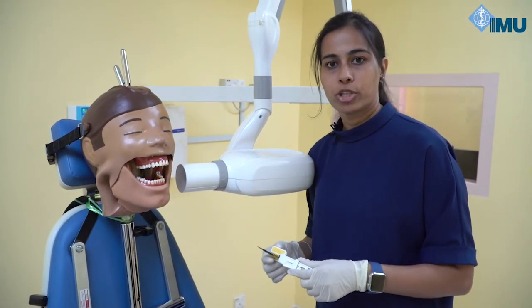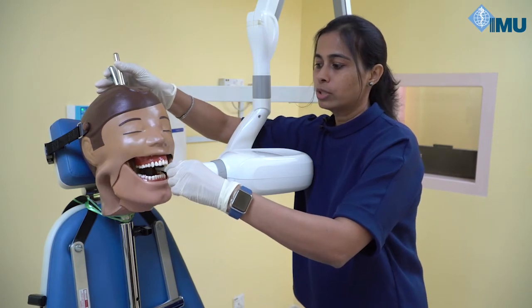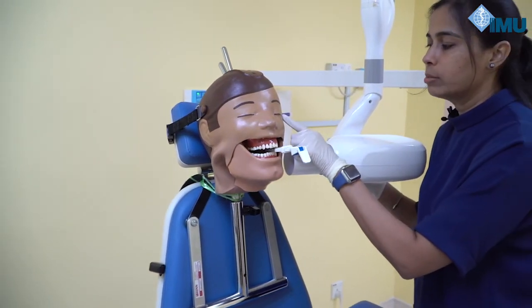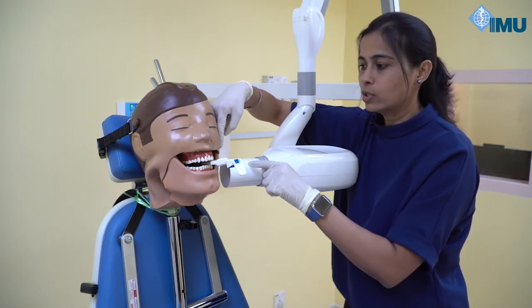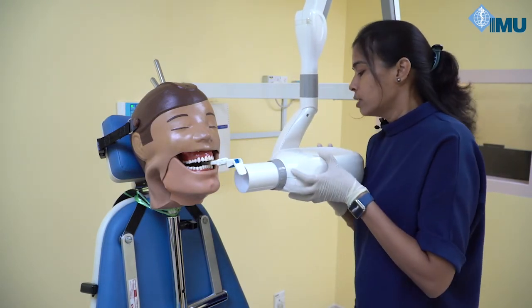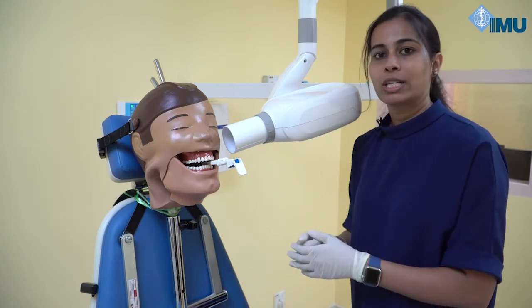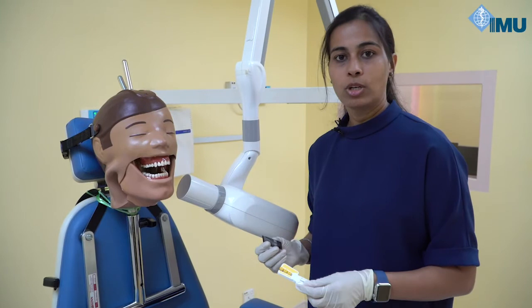For maxillary third molar projection, place the film as far back as possible, focusing on the third molar rather than first and second molar. The mesial end of the film can be at the second molar. The point of entry is one centimeter posterior to the outer canthus of the eye, where that vertical line intersects the ala-tragus line — this is the distal molar projection point of entry. The angulation is the same as first and second molar: positive 20 degrees. Exposure time is also the same at 0.40 seconds.